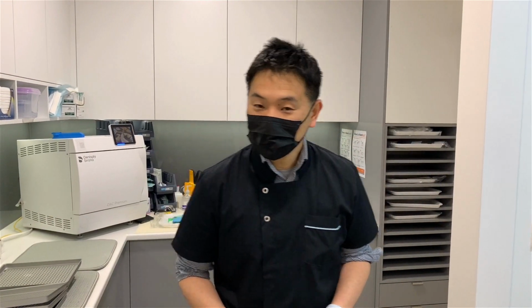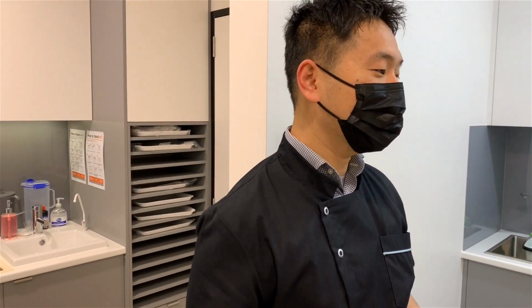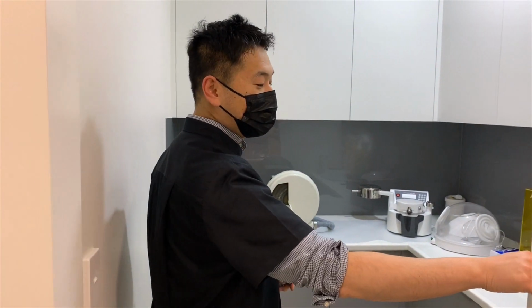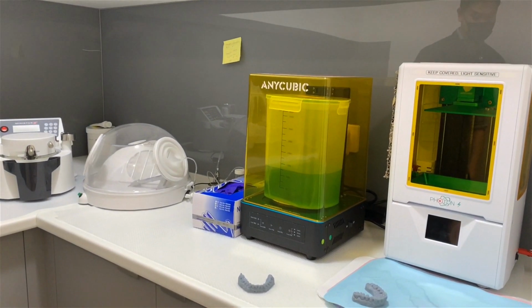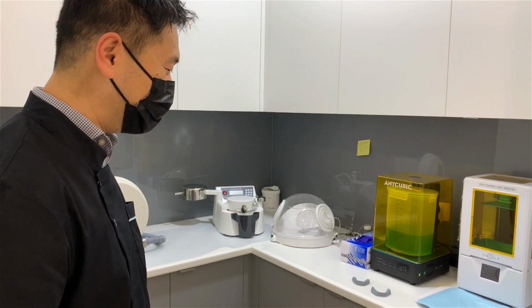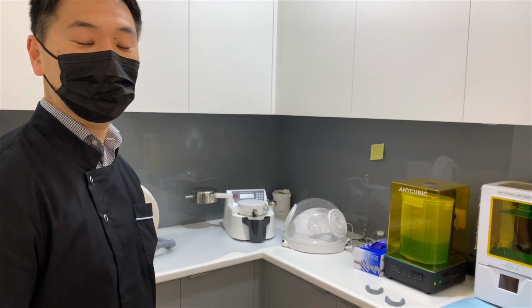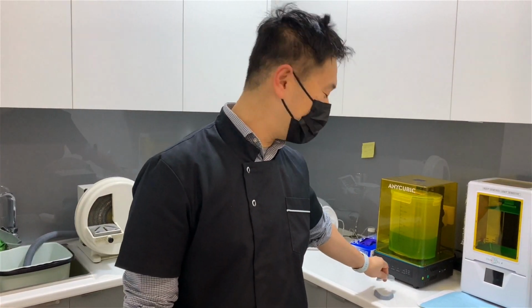In line with the whole digital clinic setup, we decided that we would slowly integrate a production line as well as the record taking line. So in here, this is our lab, where we're now printing our own digital models. We have a 3D printer, a fairly basic one to start, but we'll be evolving that as our business grows, and then possibly eventually some sort of milling machine in-house, most likely from Sirona as well.